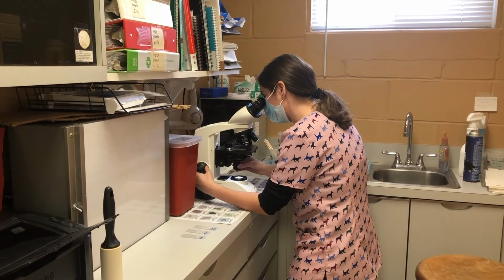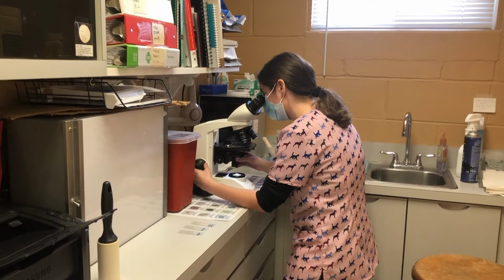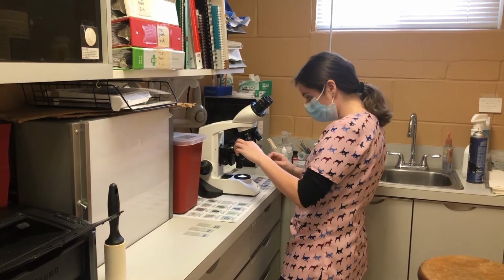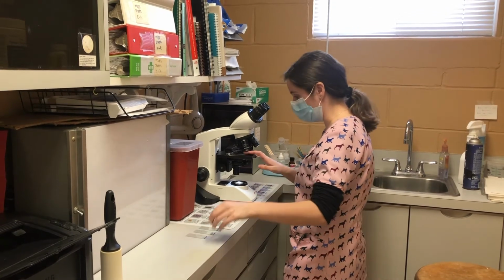And again, I'm seeing a lot of the same. There's no agglutination. The cells are all pretty evenly dispersed. Okay. So now we're going to look at our major and our minor cross matches.